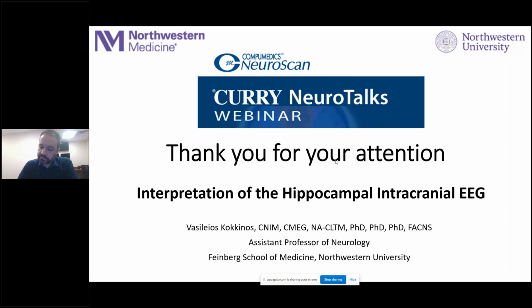Okay. And I'm curious myself, in what ways do you believe, placement-wise, that standardization is important? Do you have a set of targets that you think should always be included in a stereo case? I feel like there's a struggle between standardization and what the needs of the patient are. And I'm wondering what your own opinion might be on where stereo electrodes go and how we might be able to standardize that across patients and subjects in research.